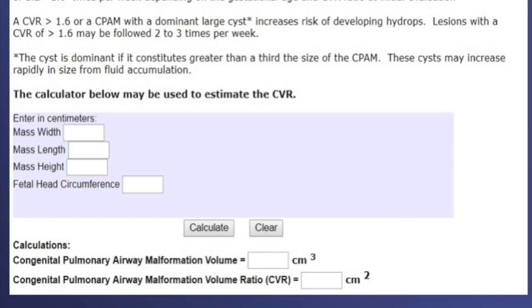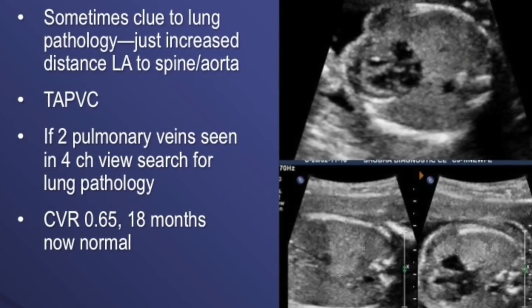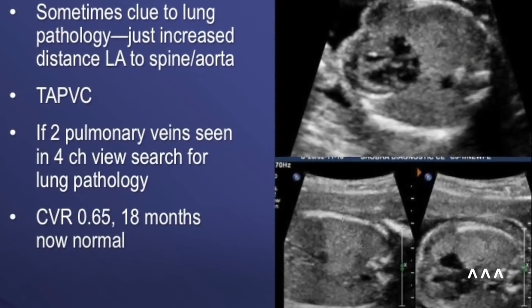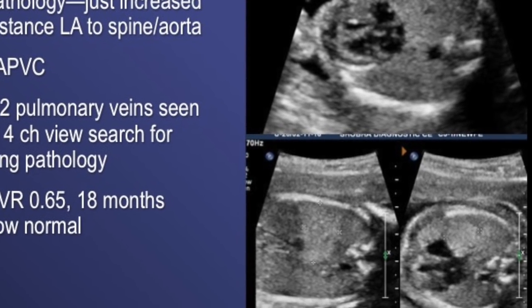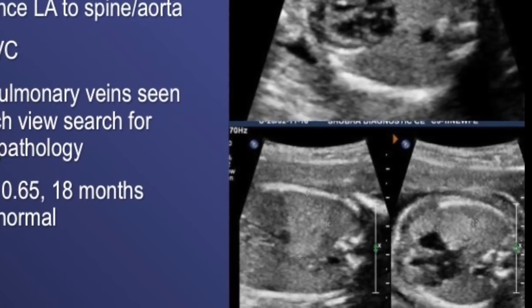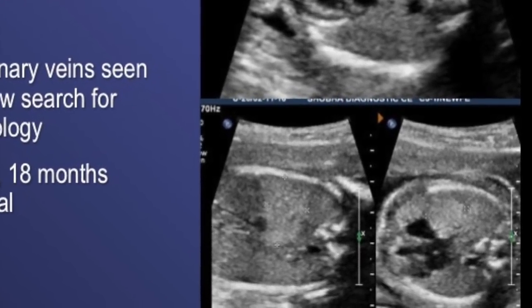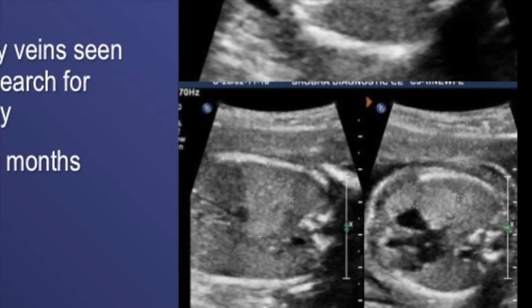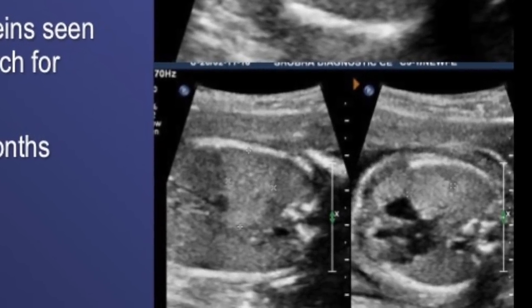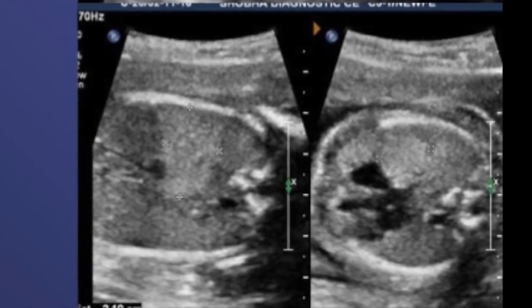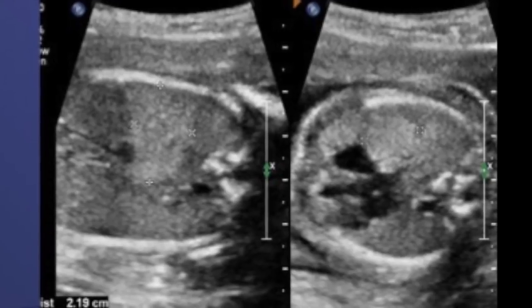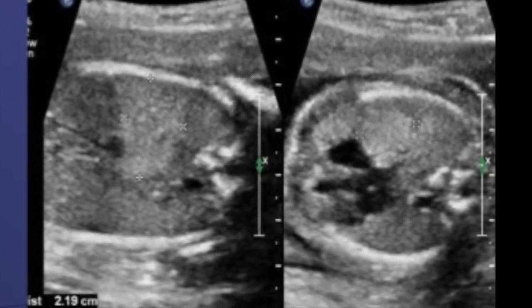Another clue to identify an echogenic lung is the increased distance from the spine to the left atrium. As you can see here, this distance has significantly increased in the four-chamber view. The close differential of this will be TAPVC — total anomalous pulmonary venous connection. But whenever you see the two pulmonary veins as ear-like projections, you know it is not TAPVC, and if you look carefully, you will see the focal echogenic lung lesion.